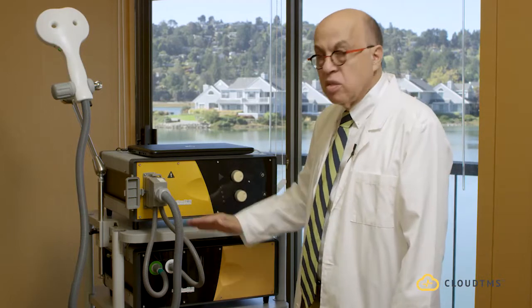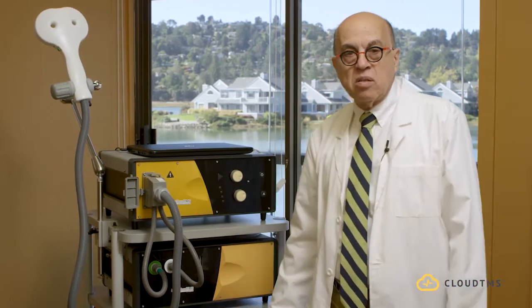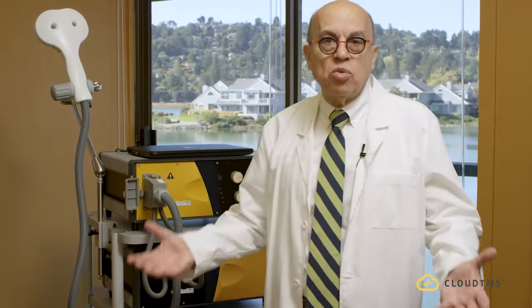The device sits on a cart, and that cart can be easily wheeled from room to room. Essentially, you don't have to hire movers to go from one room to another in your office.